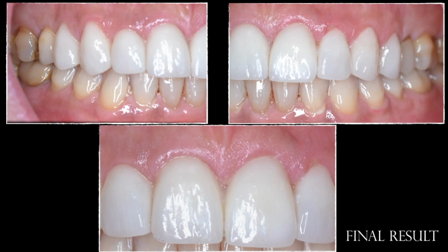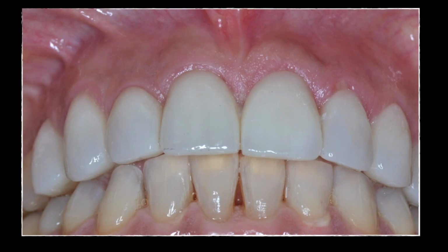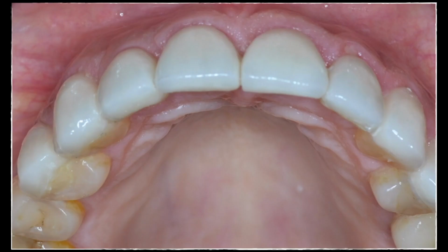It's always very attractive to see these results after 1 week or 2 weeks after placement. You see the integration and the relation with the gum. I think the result is natural, and the most important thing, the patient is very happy.